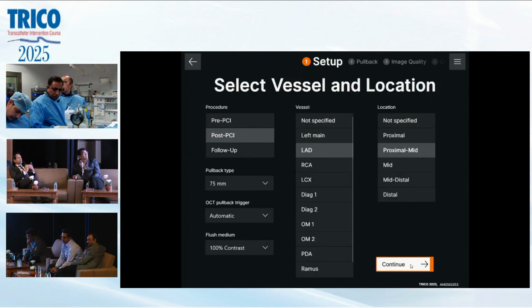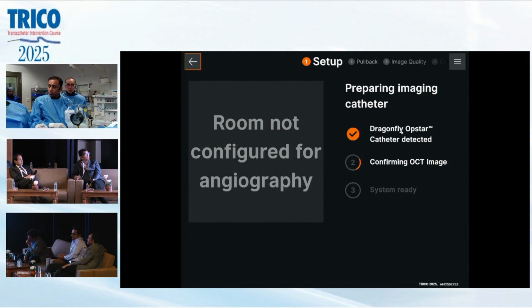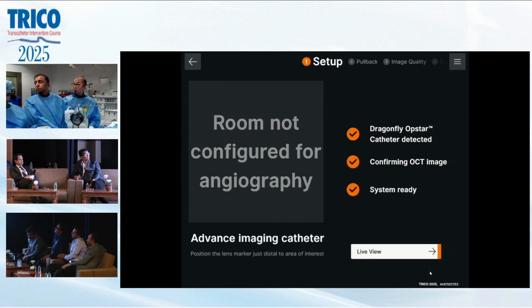Tak, in your experience, if you treated that conservatively and looked again in 3 months, would it look different? In my experience, when it looks later on, it will be totally okay. It should not be anything. This looks like artifact to me. That's many years ago, Dr. Gu did this FFR of the side branch. This is the one he always gives the lecture on. So this is most likely not significant, and he's right. Ready?